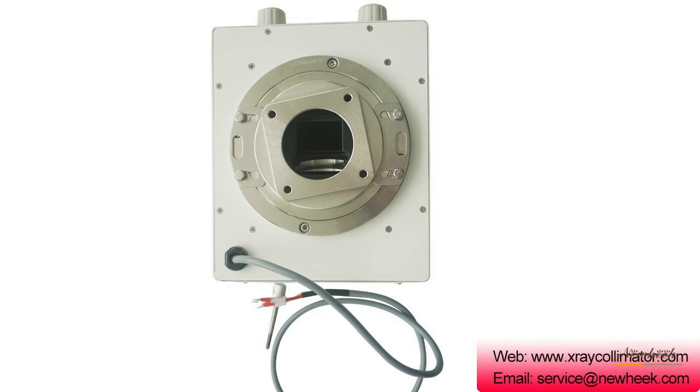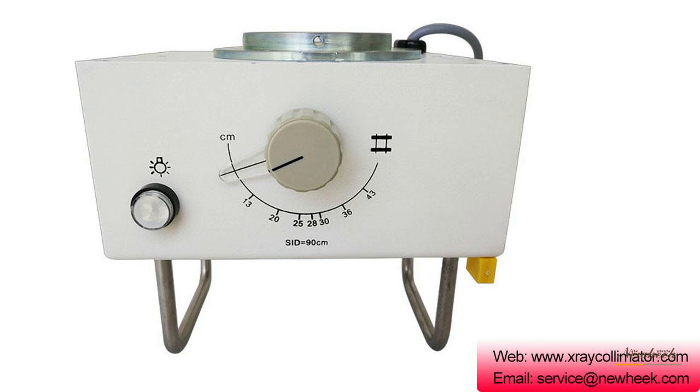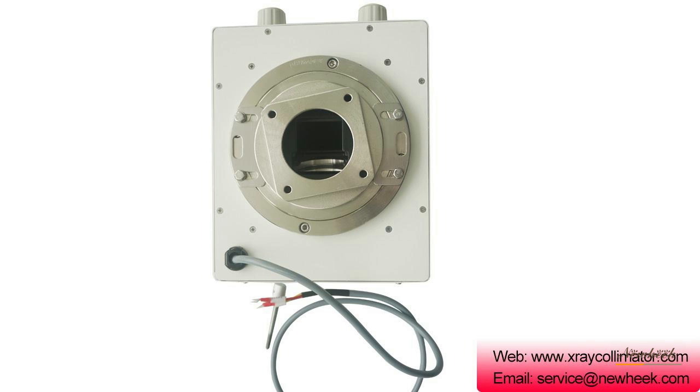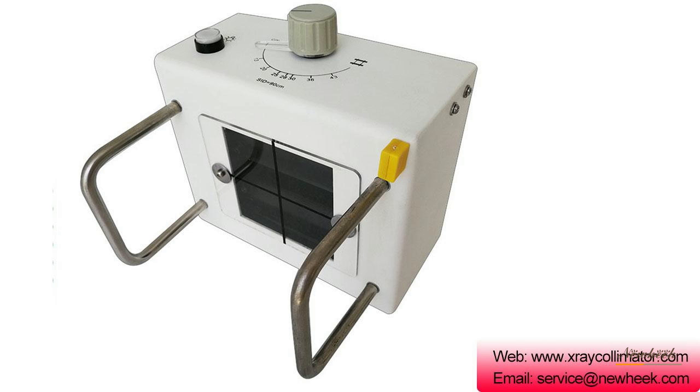Since x-ray is not visible light, it is not possible to directly determine the exposure range of the patient, so visible light is used instead of x-rays to determine the exposure field. The Newheek manual x-ray collimator control system features remote operation, easy operation, and high precision control.